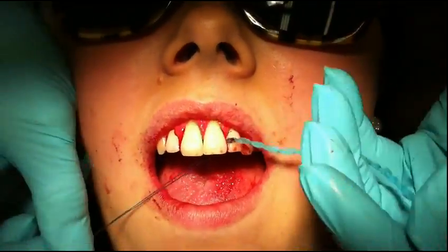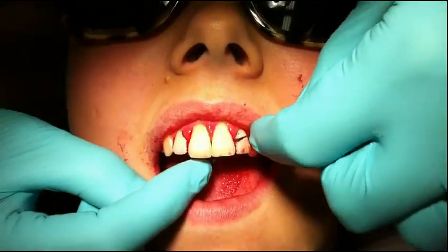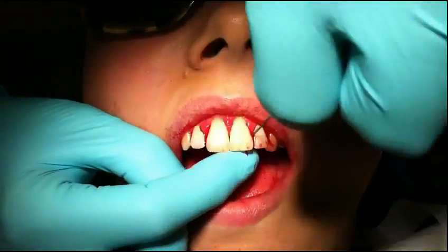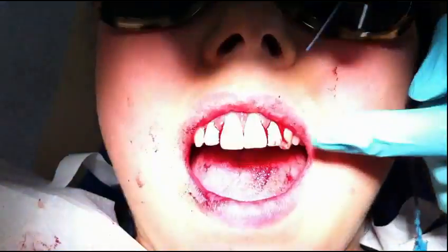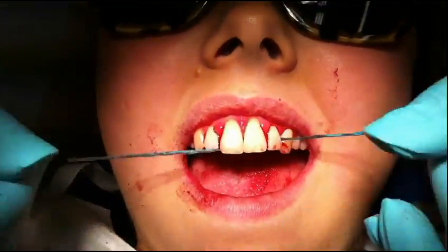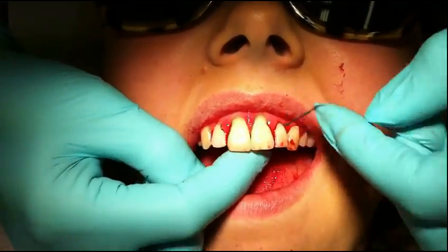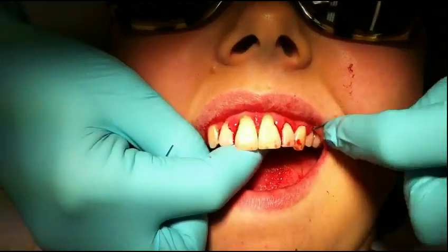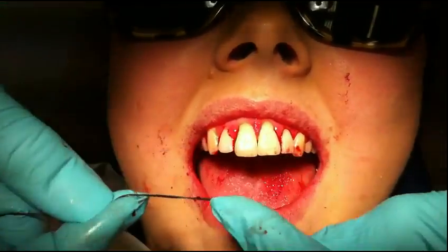Interdental brushes are not always the best tool to use because they don't go sub-gingival. Oh, we've got an open contact there, which is lovely — that's even better.